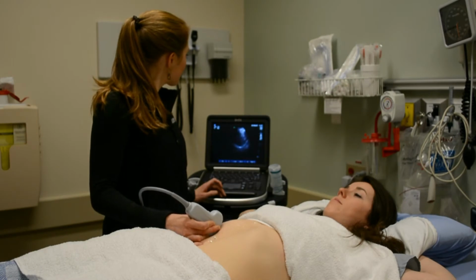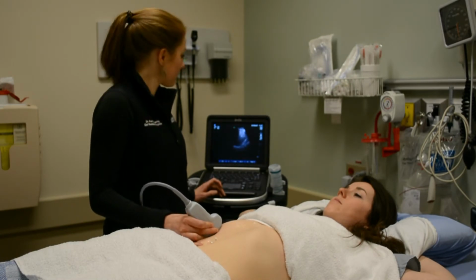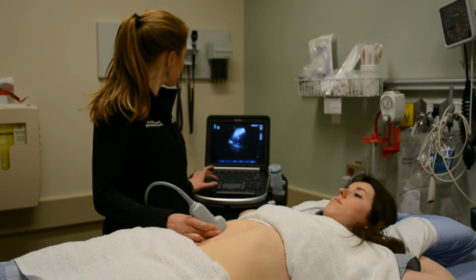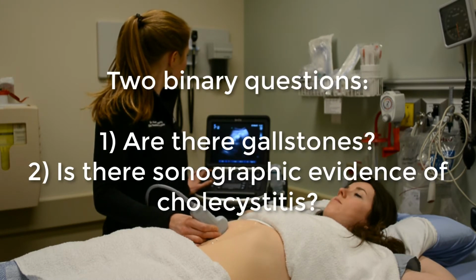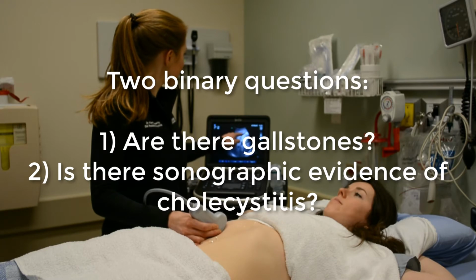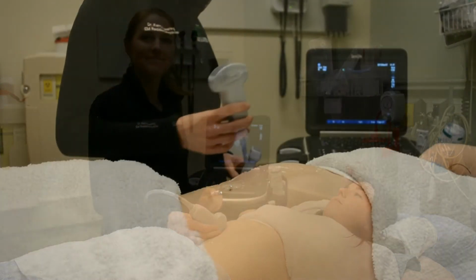Ultrasound is the most useful test to confirm or rule out gallbladder disease. Gallbladder POCUS aims to answer two binary questions. Number 1, are there gallstones? And number 2, is there sonographic evidence of cholecystitis? Let's begin with a stepwise approach to obtaining a view.